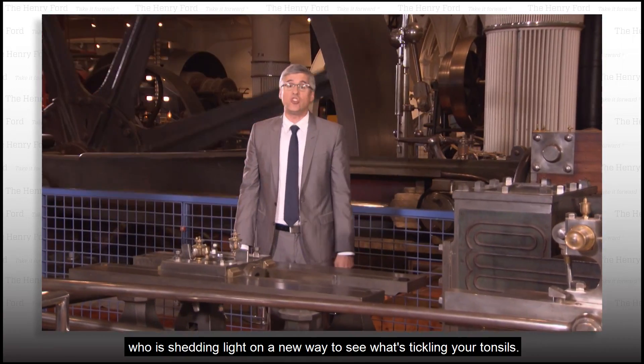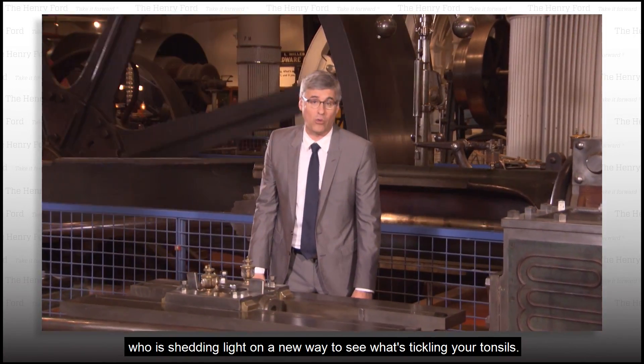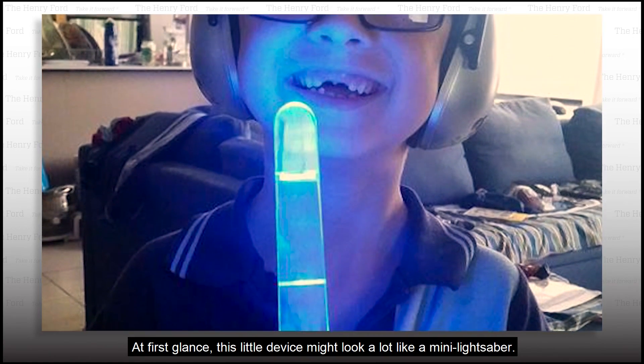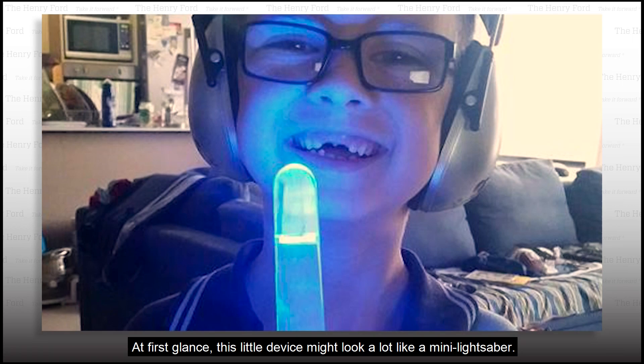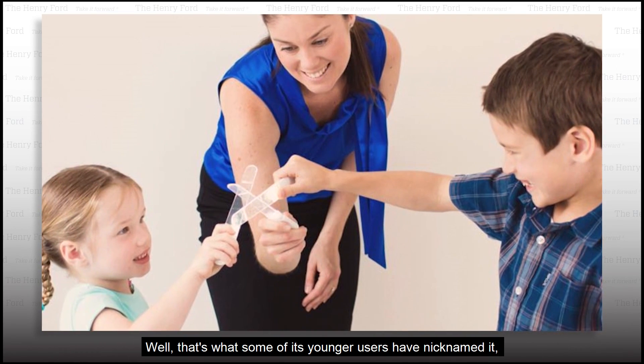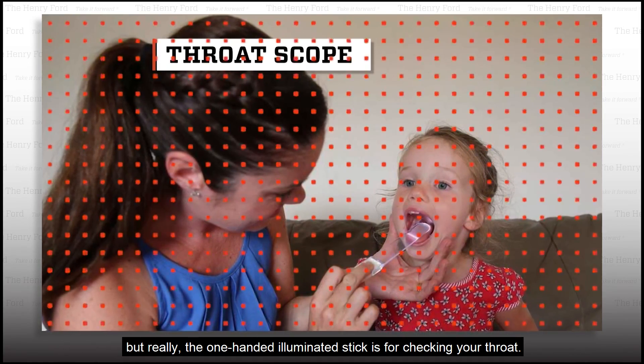Now there's a mom down under who is shedding light on a new way to see what's tickling your tonsils. At first glance, this little device might look a lot like a mini lightsaber — that's what some of its younger users have nicknamed it. But really, the one-handed illuminated stick is for checking your throat.